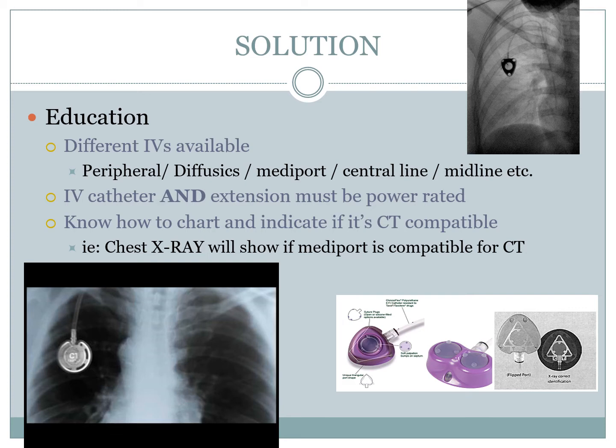Education. Education is a solution. Like they say, there's no such thing as a stupid question. Well, education is always rewarding. So here we are learning about IVs for CT scans. So it's important that we all know the different IVs that are available.